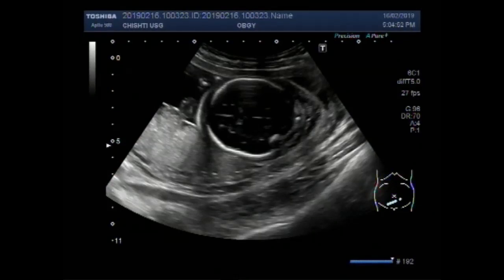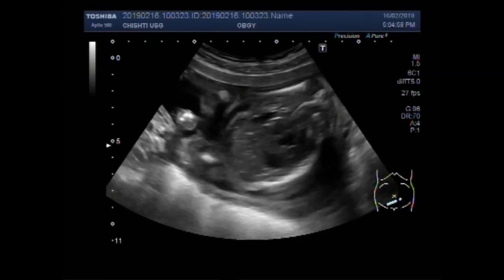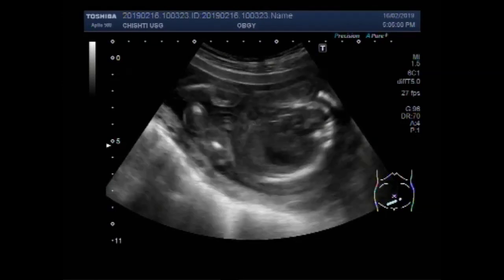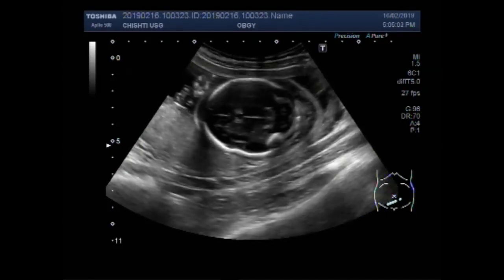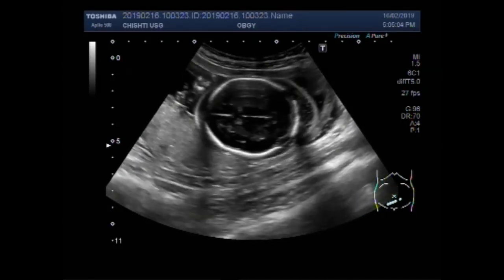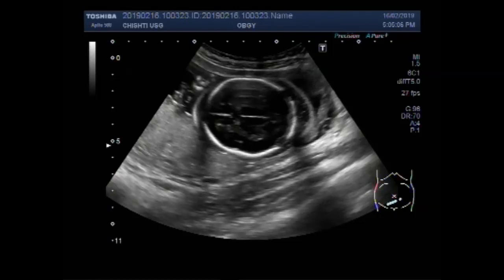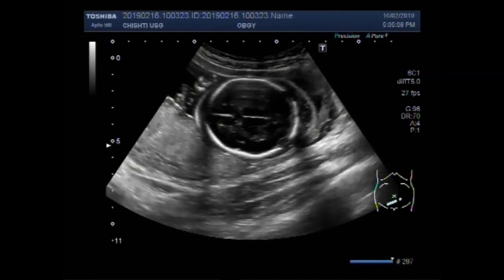Dear viewers, I hope you are all fine. This ultrasound video shows a fetus with fetal demise — that is intrauterine death of the fetus — with positive Spalding sign and soft tissue edema also seen.